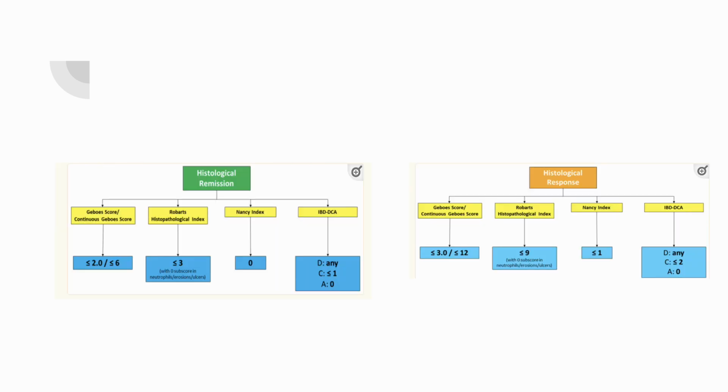The reason this classification system is important is because we can identify how our biologics or the agent that we're using to treat is working for our patients. Specifically, you can use this classification, and this is what you would look for to see if your patient's in remission versus a response to the agent itself.